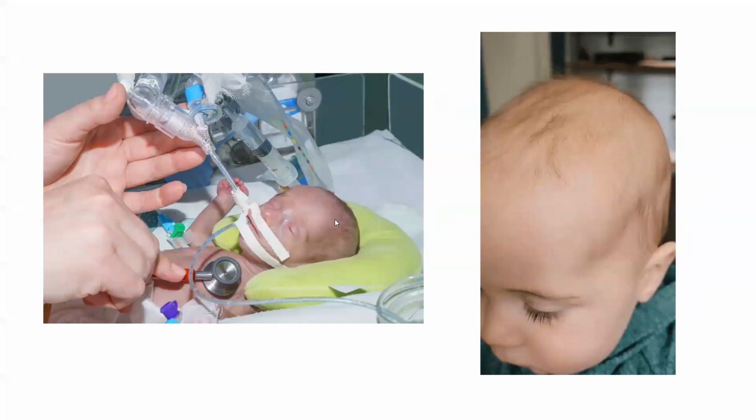So let's get you interacting. So this is a preterm baby. This baby's 30 weeks, intubated, ventilated. Any idea what frequency and what probe you'd like to use?